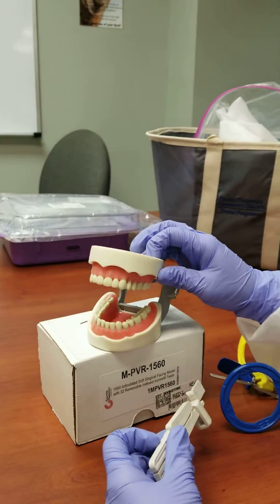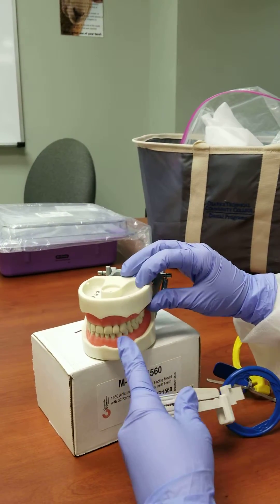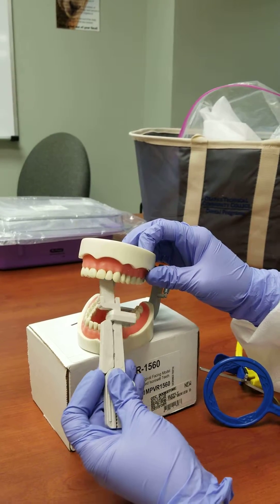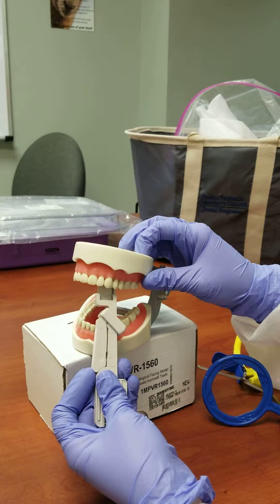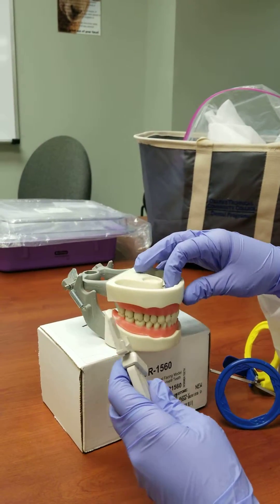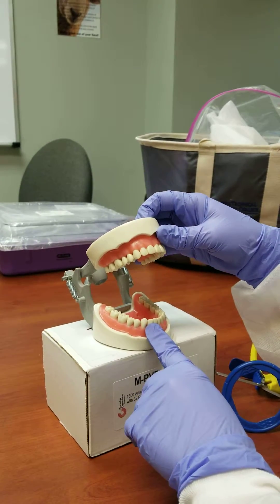Then I'm going to do a PA of number 11, which is the left maxillary canine. Then I'm going to do a PA of number 26, which is the right mandibular lateral incisor.